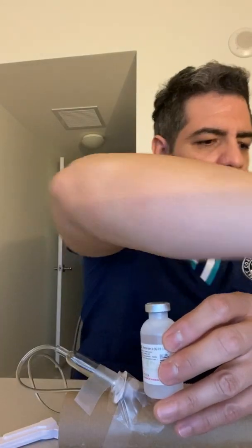I already have inspected the medication for color, clarity, and expiration date. I already did the calculation, but I'll repeat it. The doctor's order was 2 milligrams IV every 4 hours, and that will be 1 ml that has to be given to the patient. Then the next thing we do is we open the vial and we clean the top part with alcohol.